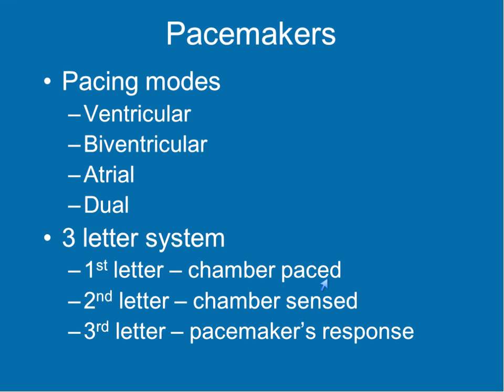then it will go ahead and allow the pacemaker to pace. So if I've got a pacemaker, atrial, ventricular, dual, the atrial wire will sense what's going on in the atria. And if the impulse is coming out of the SA node like it should, the wire up here does nothing. That impulse gets to the AV node. Does it make it through? If it makes it through, then the wire in the ventricle does nothing.